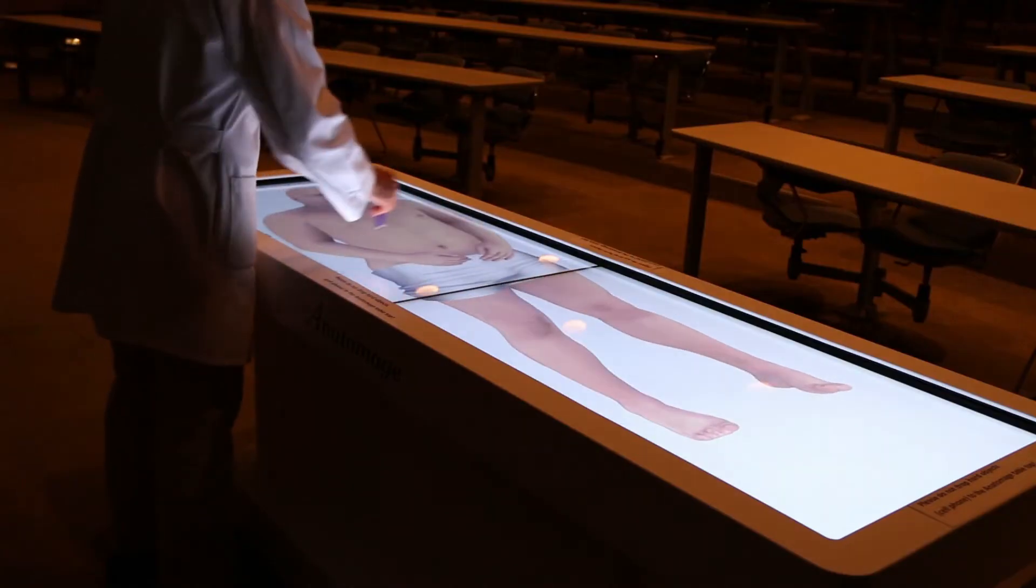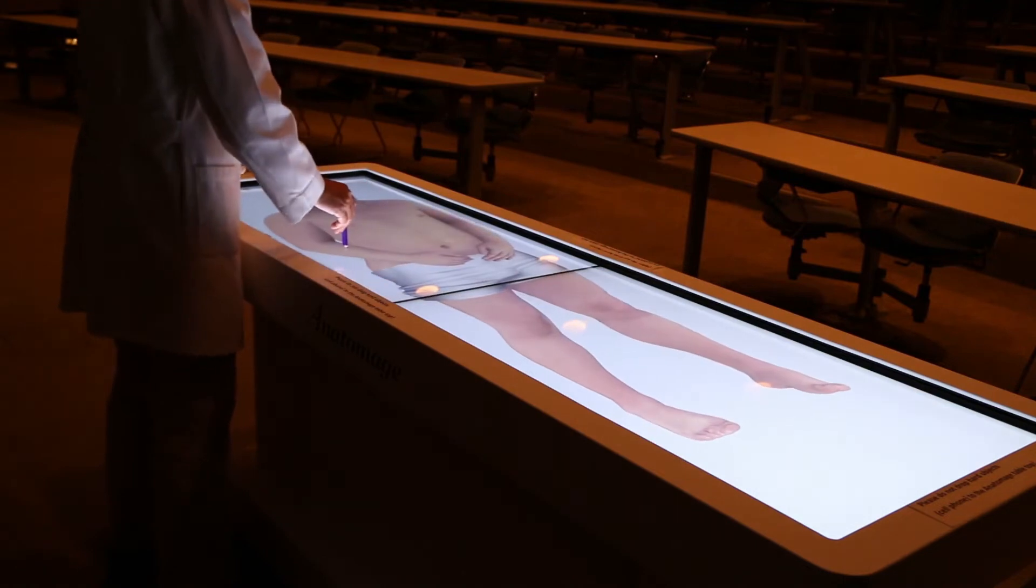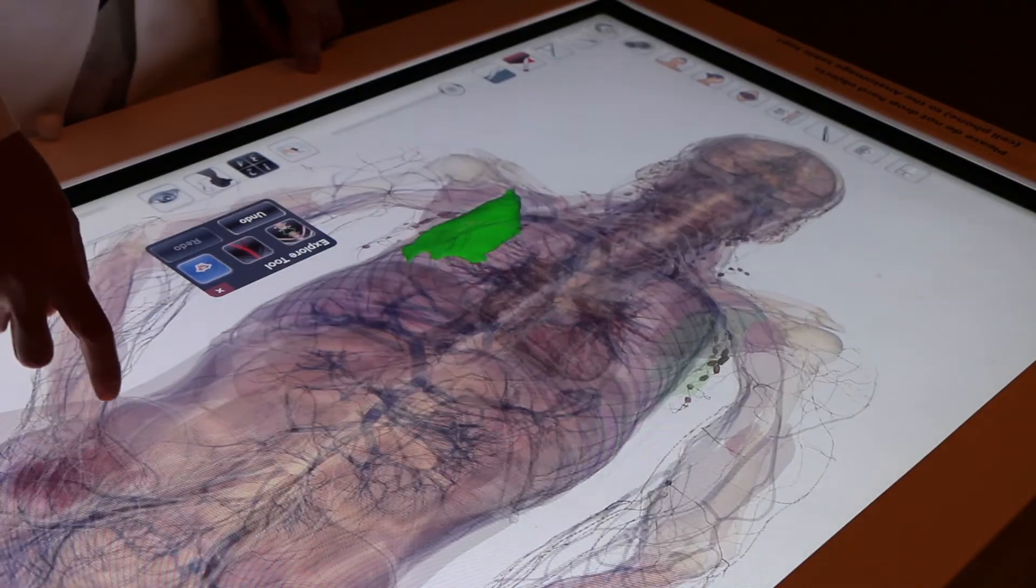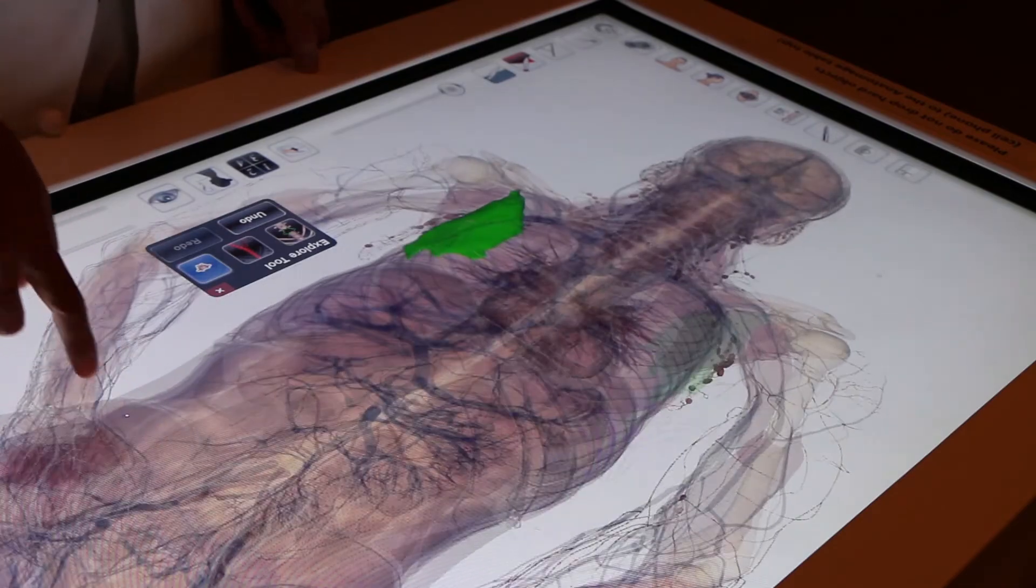Before we had the table, to rotate an image and illustrate the three-dimensional structure or relationship of a particular structure, we had to use many frames of static pictures to illustrate the concept. It's not as effective as just one second rotation of a 3D image.